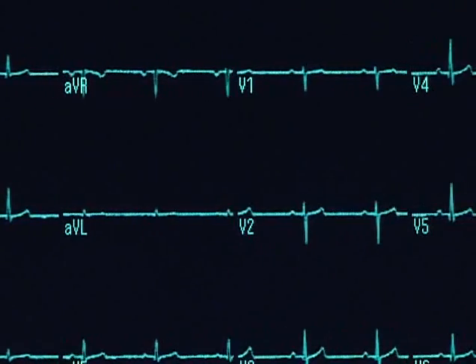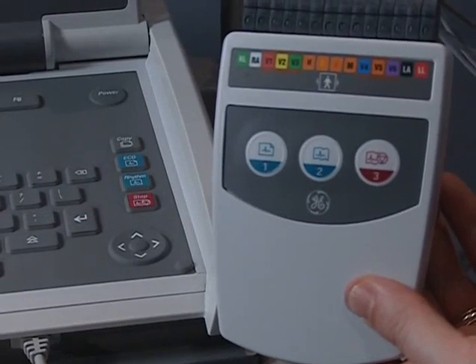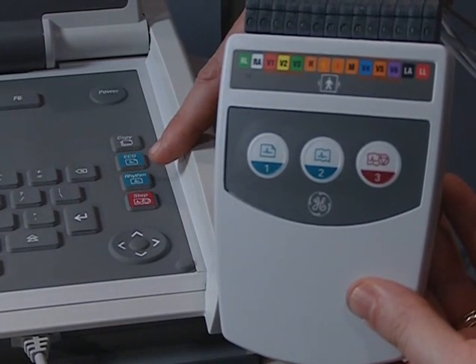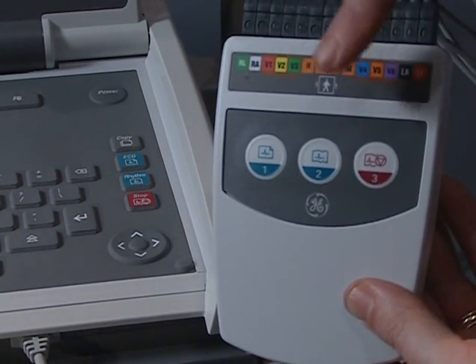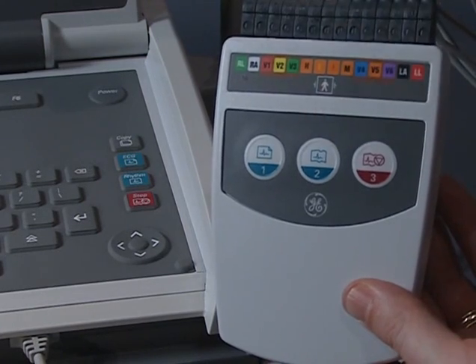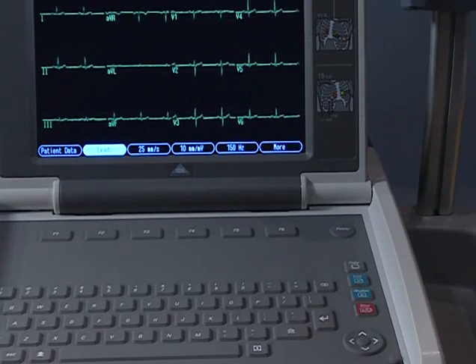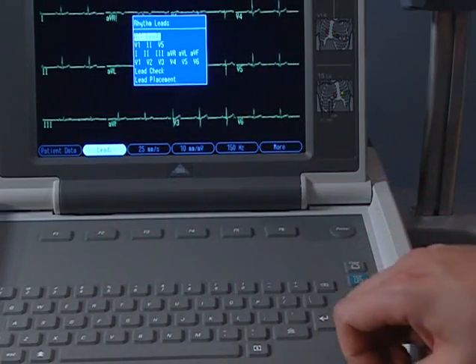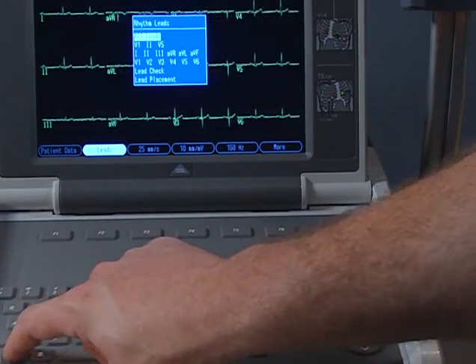It's also very easy to acquire a rhythm strip. Simply press the Rhythm key on the keypad or the second button on the acquisition module to begin acquiring a continuous rhythm. Default leads appear first. Specify other leads by pressing F2. Press the Stop key to stop printing.